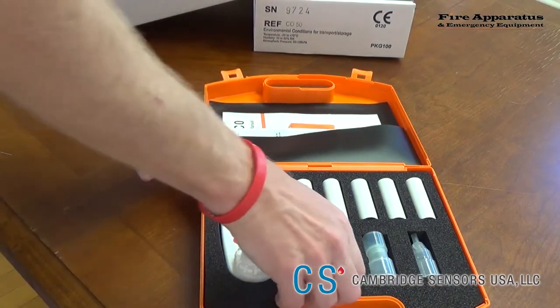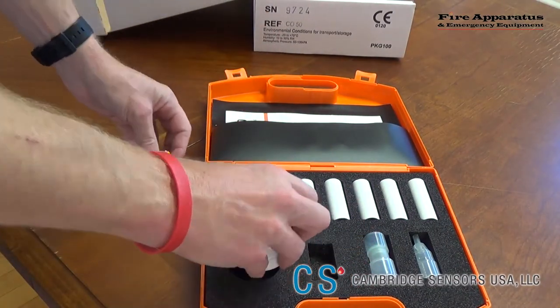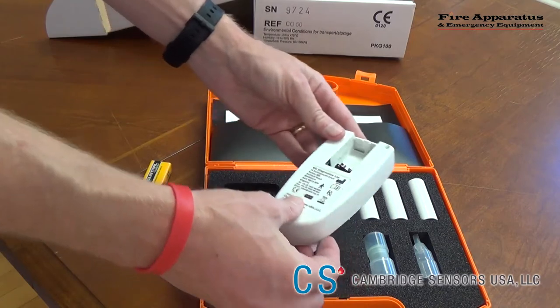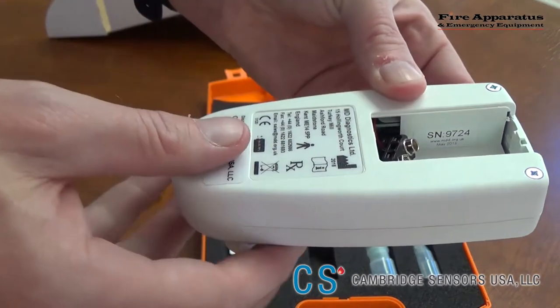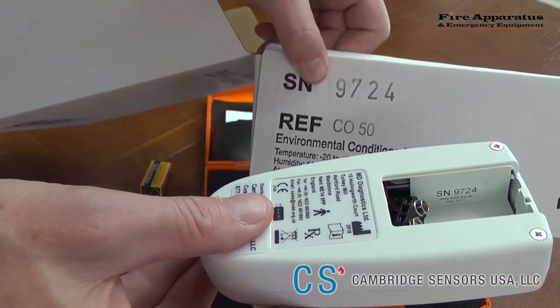To get started, you will need to install the battery. Installing the battery is simple. Turn over the unit and remove the battery plate. In the unit, you will find a serial number right here. That serial number will match the serial number that is on the box.